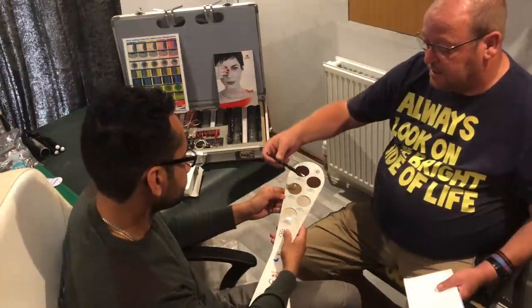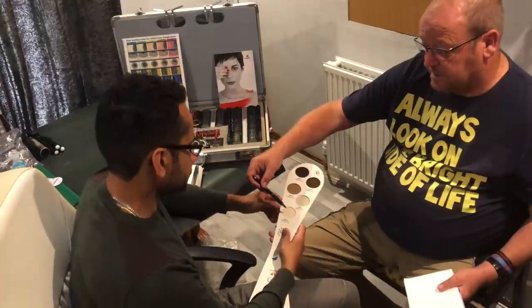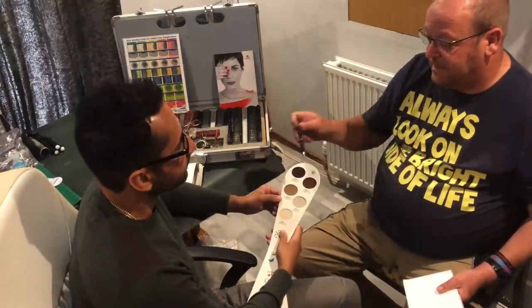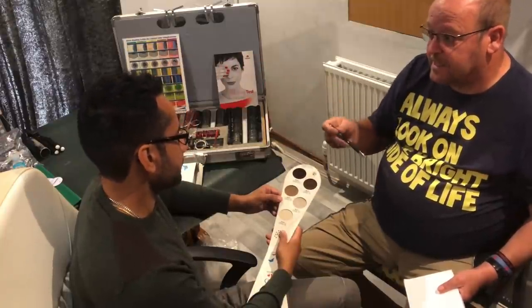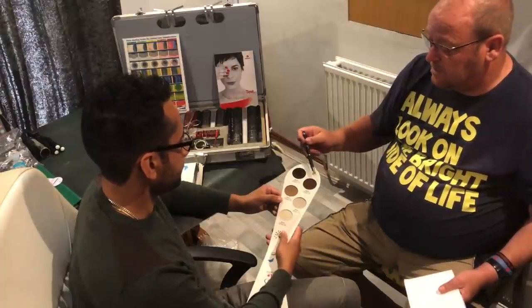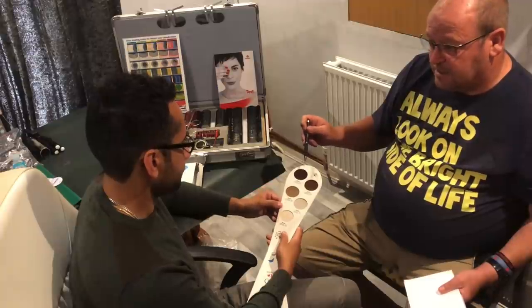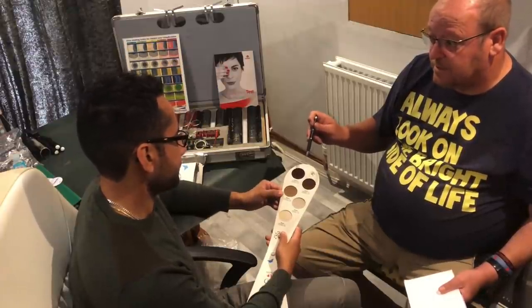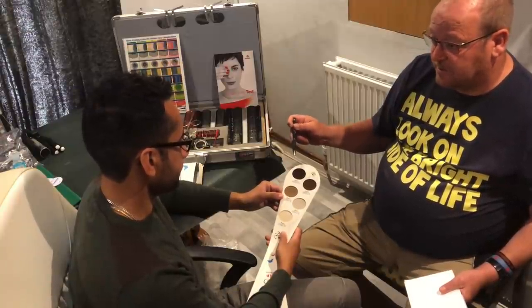If you're driving at night, this lighter colour will be the darkest I'd recommend for driving at night. The reason for it — if we cut out some of the light, you're going to miss a lot of the detail. It's already dark. When it comes to the darker tints for driving in the daytime, there is legislation for what you can wear when driving.